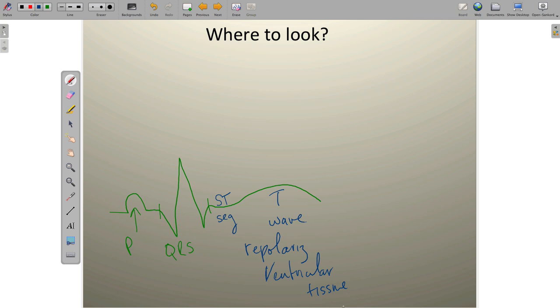So at what point does ventricular depolarization end and ventricular repolarization begin? The answer is at this magic point known as the J point. The J point is nothing more than the junction between ventricular depolarization and ventricular repolarization.